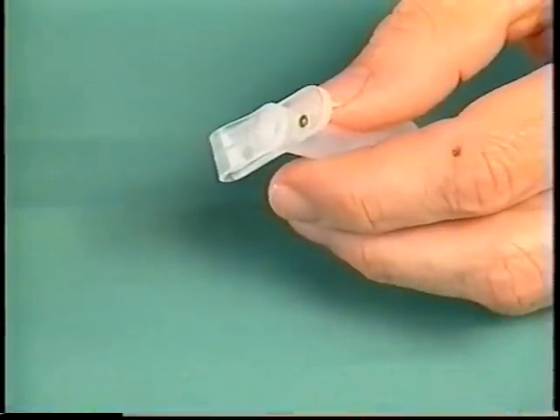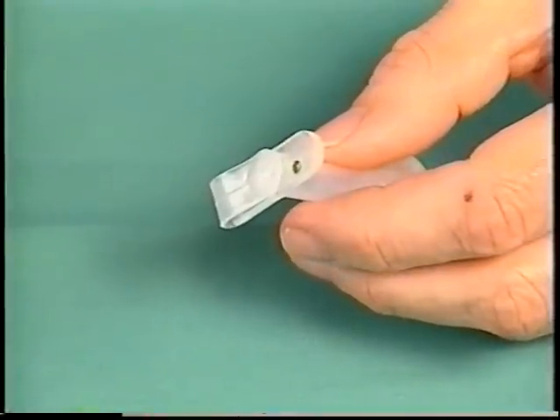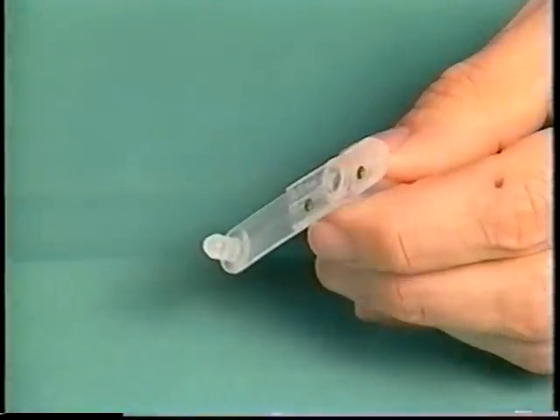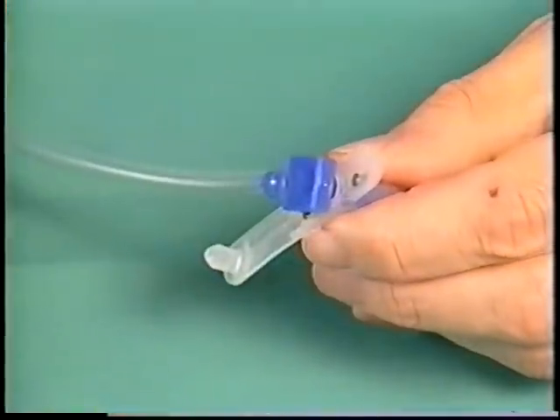Decompression of the stomach may be ordered by the physician before or after feedings for the purpose of removing air. To decompress the stomach, the cap on the PEG tube feeding port should be opened. Then a decompression tube is attached to the PEG tube and the stomach is allowed to drain as prescribed.